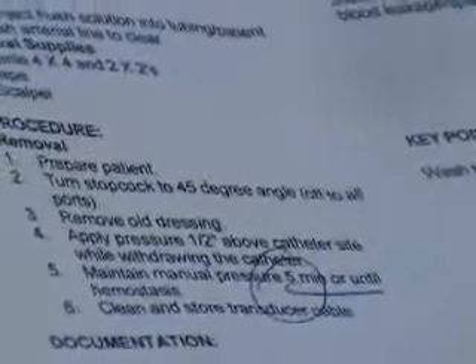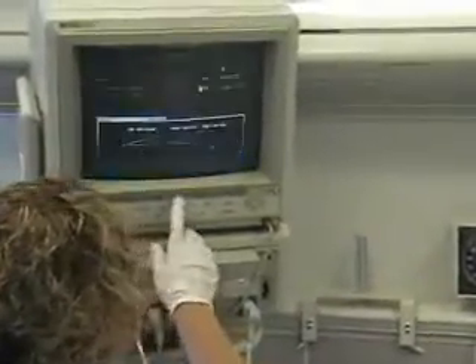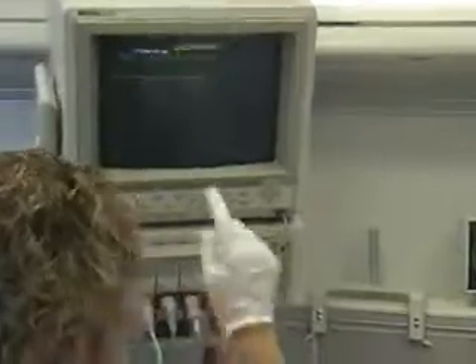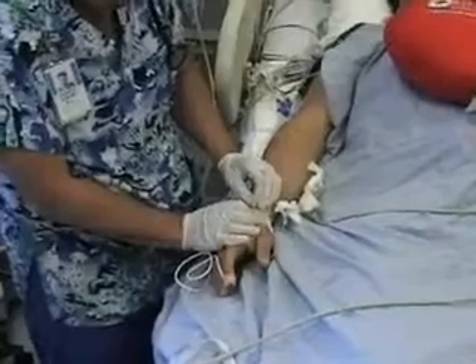We're going to turn our alarms off and down — here on the volume control — so that the noise is at a minimum. Mike, we're going to pull a little tape here.